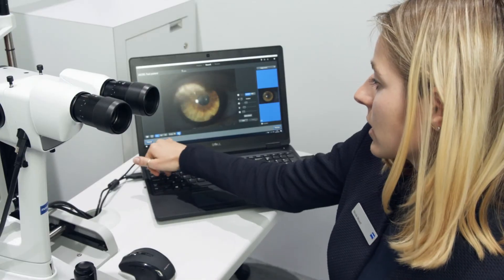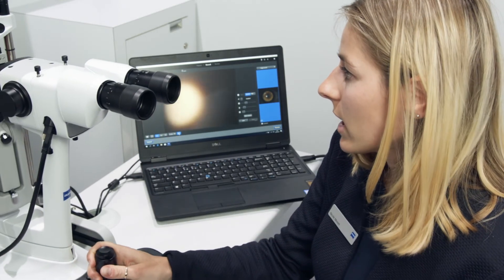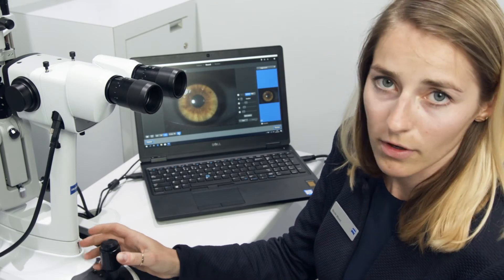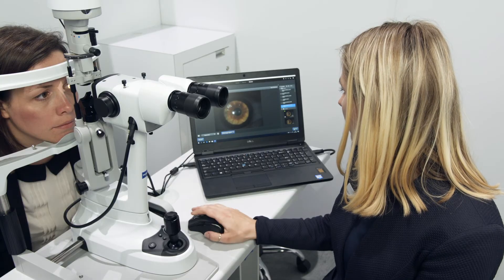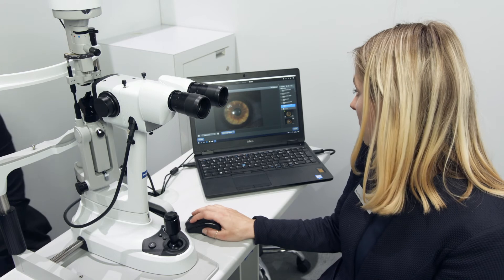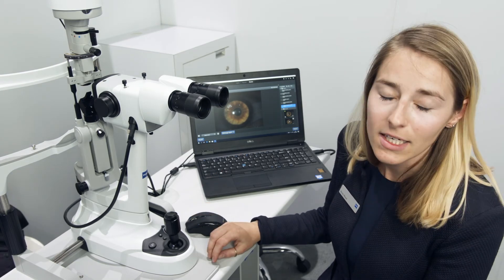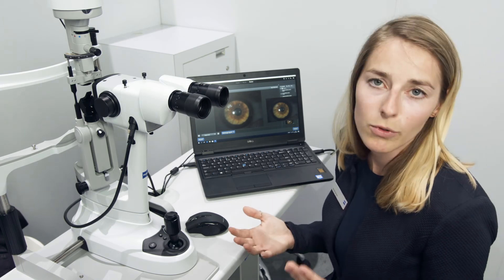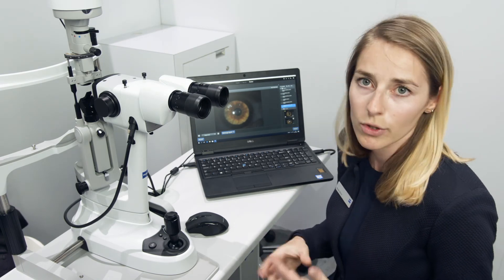We have automatic detection of OD or OS, so the slit lamp recognizes which eye is in front of it. You can review all your images under the review button and create reports or export images and reports to forum or to any network drive.